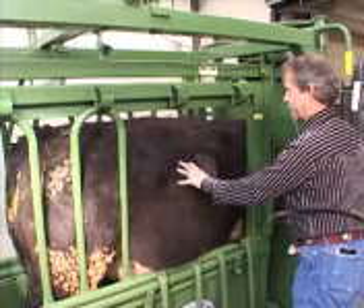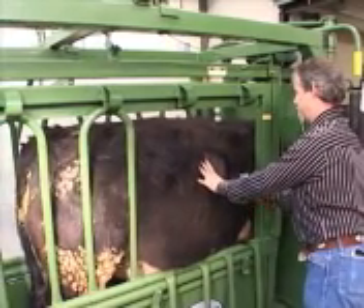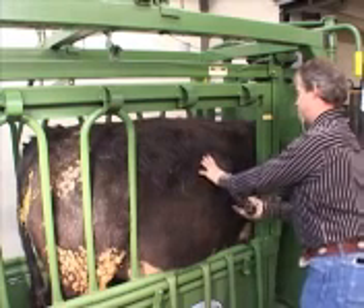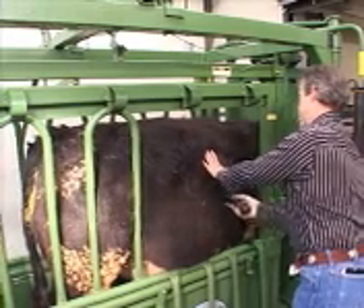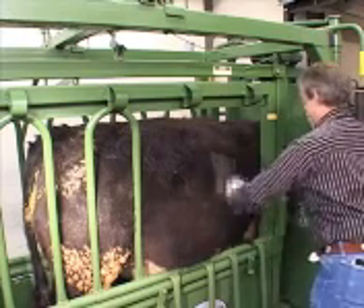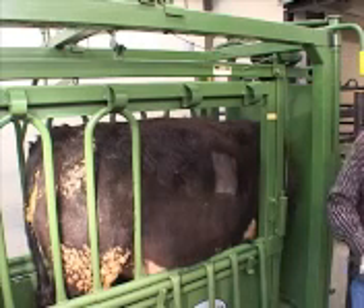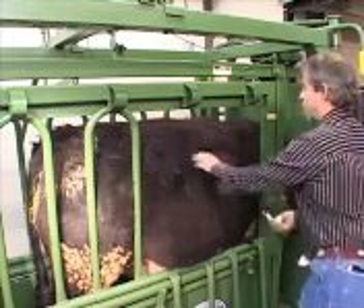Okay, first rib, second rib. It's not going to hurt him to lose a bit of extra hair — make it a little bit wider open and easier to see. Let's do a quick betadine scrub.